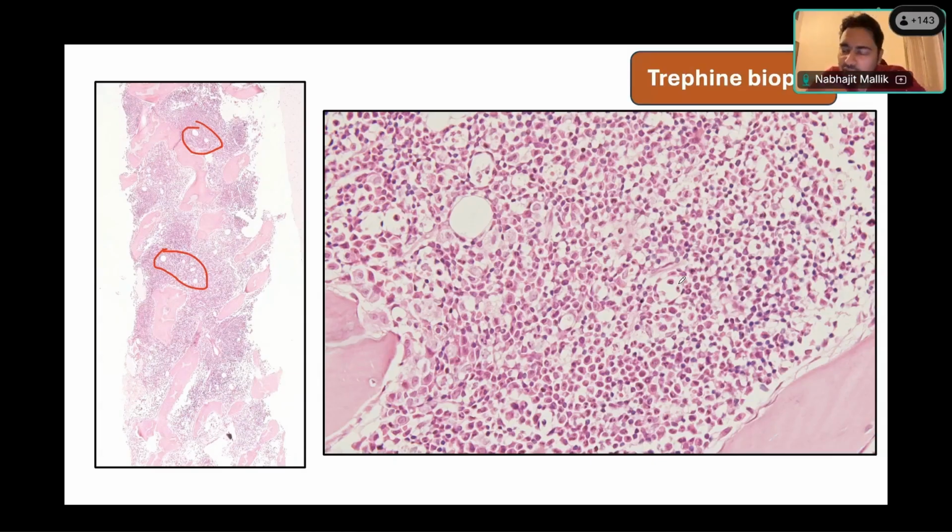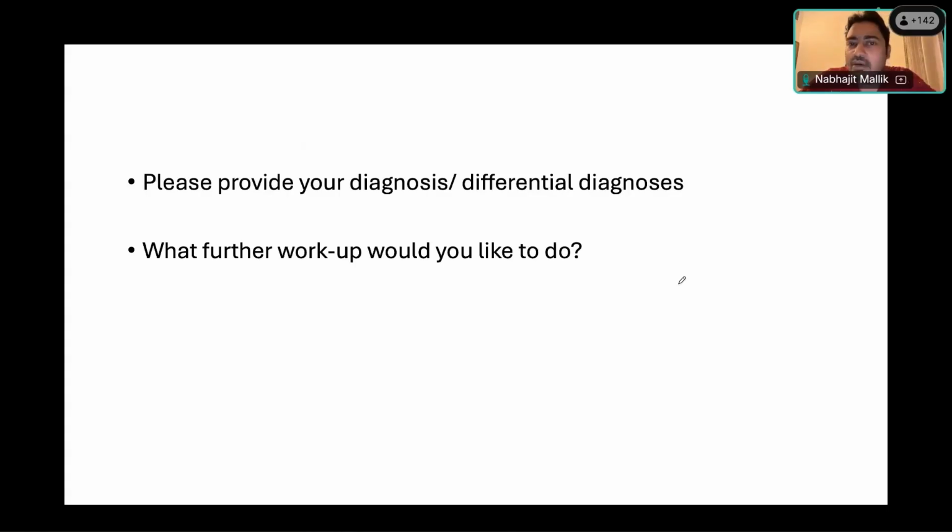What now? Can we further go ahead and what special type of PRCA is this now? This now, remember, a 4-month-old. Yeah. So congenital, right? This looks like a congenital pure red cell aplasia. Absolutely wonderful. So this looks like a congenital pure red cell aplasia. Why? Because it is a 4-month-old baby. 4-month-old baby, right? Very, very early. Okay. So how do you further go ahead?